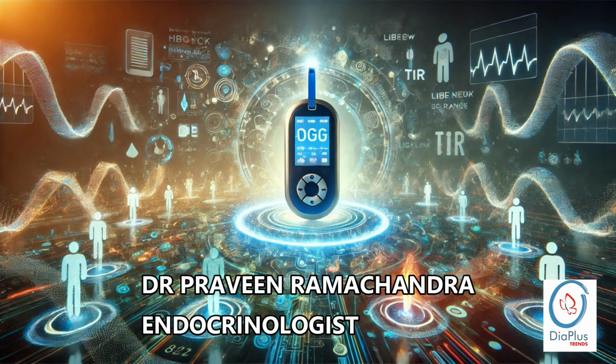So you're already pretty familiar with these advancements, but let's unpack why this shift is such a big deal. What's really fascinating is that we're moving away from just a static snapshot of your glucose control and going towards a dynamic understanding of how your glucose levels actually fluctuate throughout the day. A1C has been the go-to measurement for years, but we're starting to see more and more just how limited it really is. Yeah, I've always thought of it as an average over time. Exactly. But how does that limited view affect our ability to actually manage diabetes well?